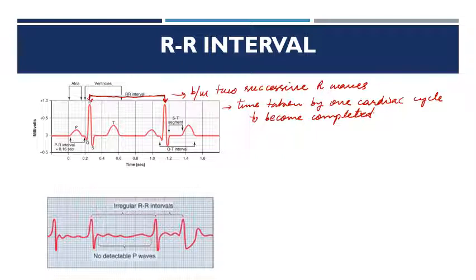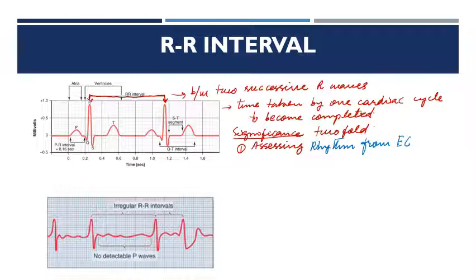The significance of RR interval is twofold. Number one, it helps in assessing rhythm from ECG.